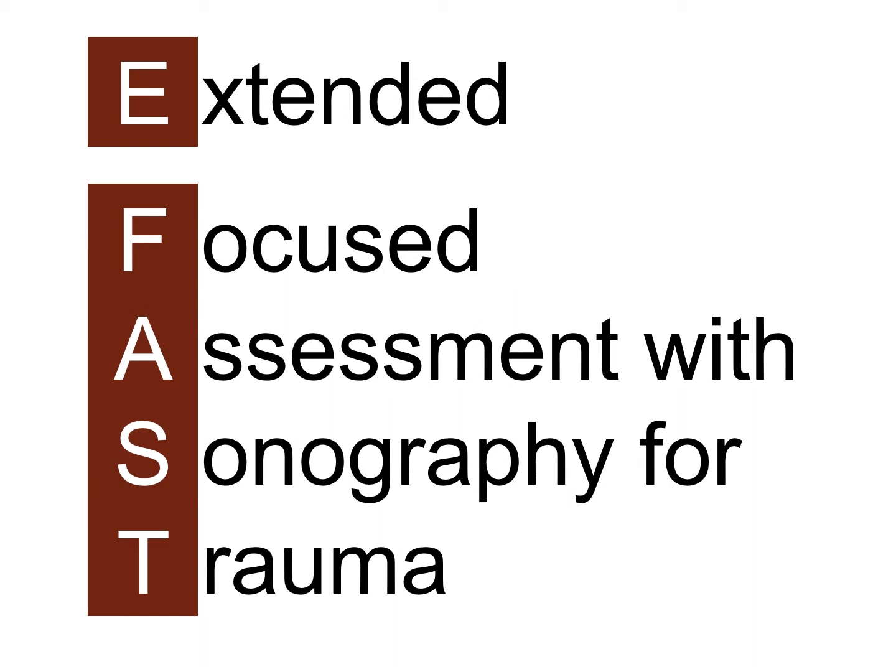Now you'll hear people talking a lot about the e-FAST, which is the extended FAST exam, which is really just the FAST exam with lung views added in, and it's extended because that wasn't part of the original FAST exam, wasn't part of the original research that developed the FAST exam, but it's included in it now, especially for trauma patients.